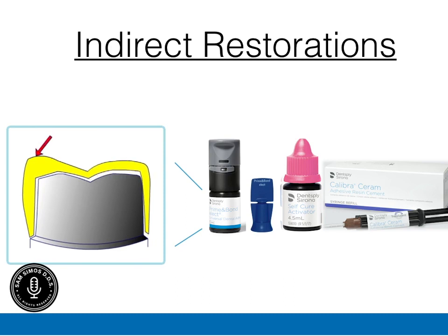I'll clean it up. Clean up is a breeze. I clean up interproximally and buccally, lingually. And then I'll go ahead and do a 20-second cure on the buccal, 20-second cure on the lingual, 20-second cure on the occlusal. And that's it. Check the margins again. You're all done. It's a great way to cement a crown very, very easily with very little fuss.